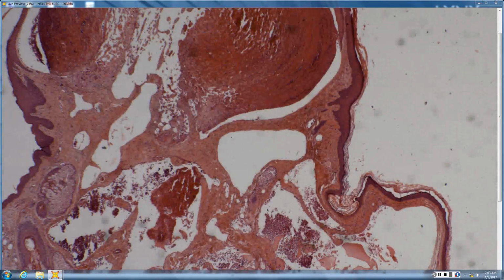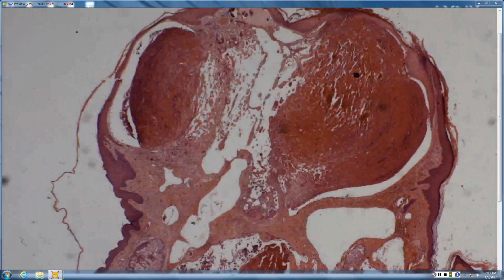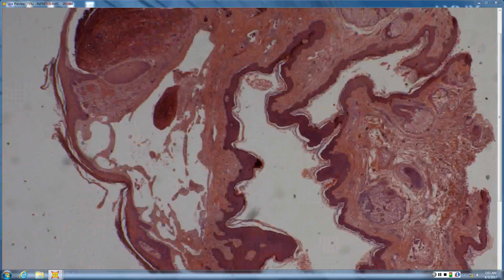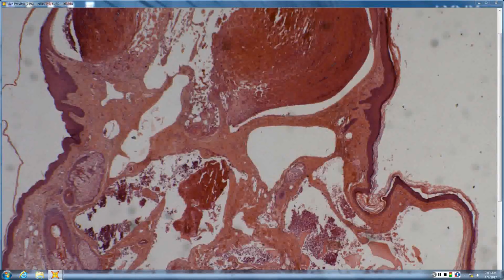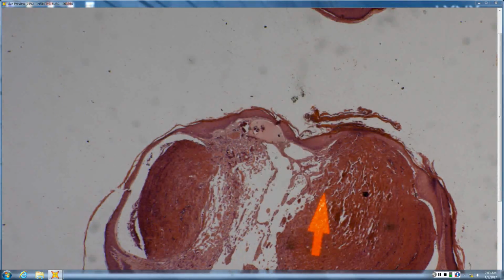Okay. Number 7, this is one of 3 IPEH, or the intravascular papillary endothelial hyperplasia, or Mason's tumor. And that can happen in kind of anything vascular. This maybe was like a lymphangioma, or probably not an angiokeratoma, but in any sort of hemangioma or vascular proliferation or anything, you can get a thrombus, which is what this is here, and then as the body starts to attempt to recanalize that, that's where you get this IPEH.